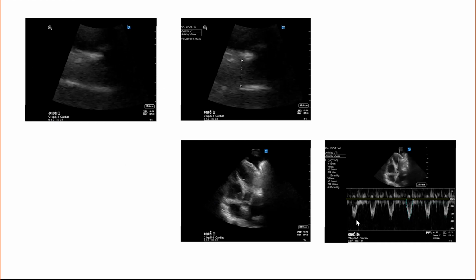Also important to remember the little valve clicks that you can see sometimes. What you want to measure is the LVOT and not at the aortic valve level, because that will give you a higher number. So if you see a lot of valve clicks, you have to come back on it, just pull the sampling volume down a little bit, and then you will get the LVOT. If you measure this, then the machine will automatically calculate the VTI. Here it's 9.13.